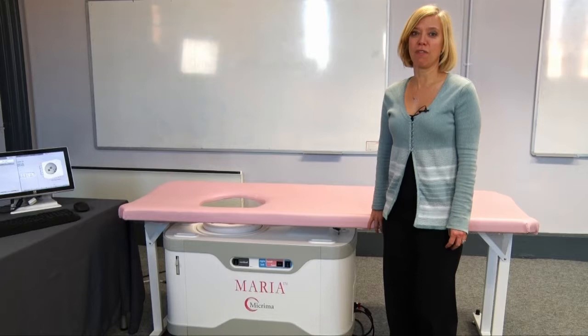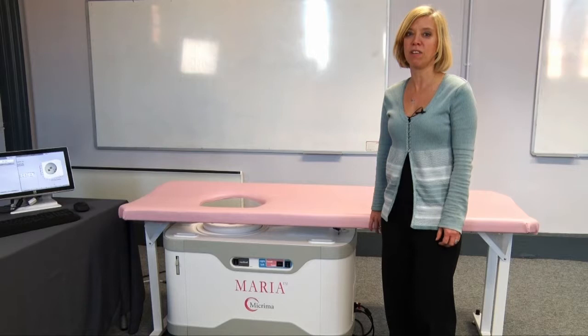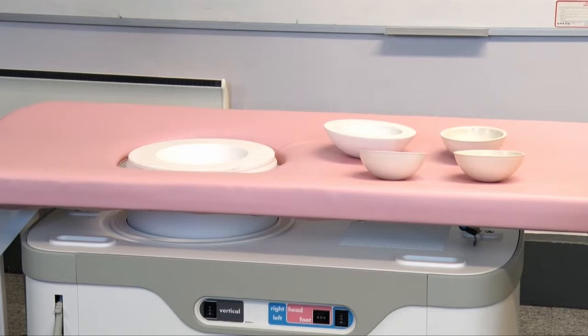Welcome to this video from Micrima introducing you to the Maria system. This video will show you what the system comprises of. It is not intended to replace any previous knowledge or any medical judgment.